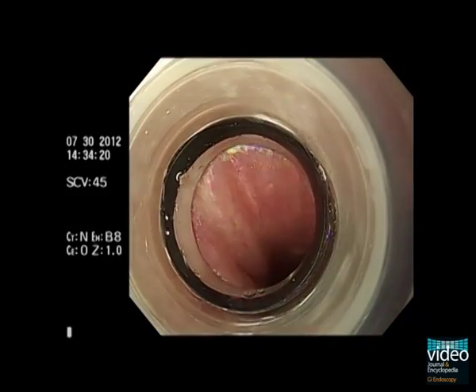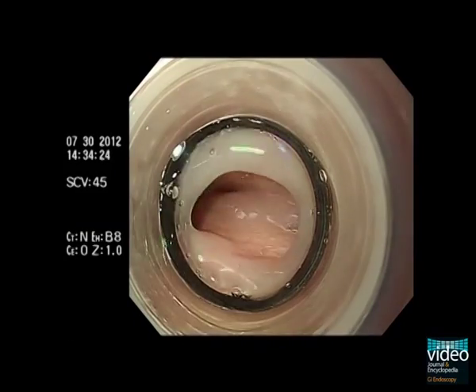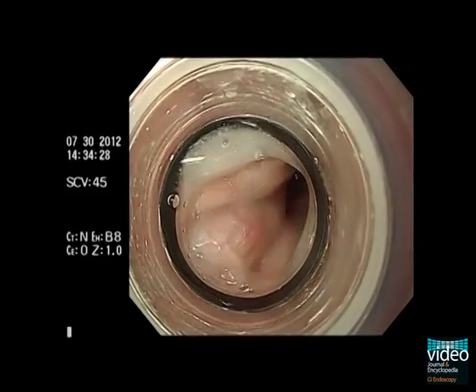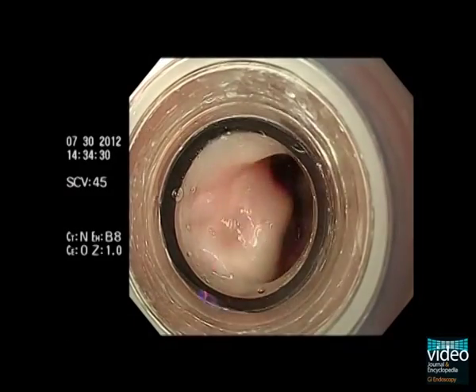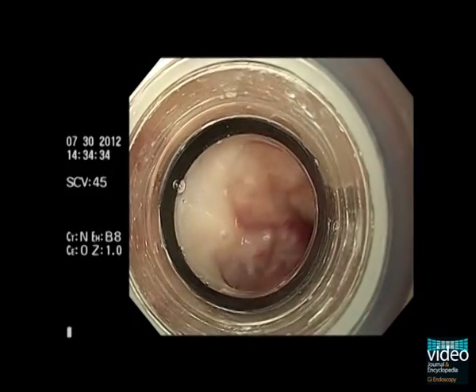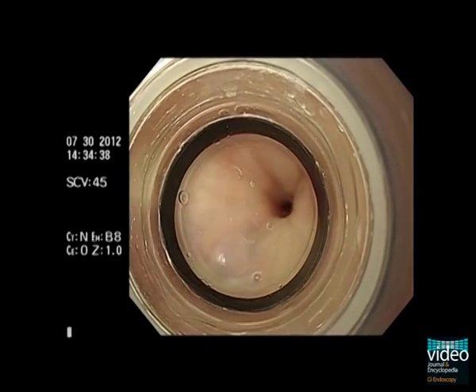The ligation procedure starts from the most distal varicose vein and moves up towards the mouth. Once the varicose vein is ligated, the endoscope should not advance distal to the ligated area because this may cause band dislodgement. We usually place 4 to 6 bands in one session and repeat the procedure every 2 to 4 weeks.